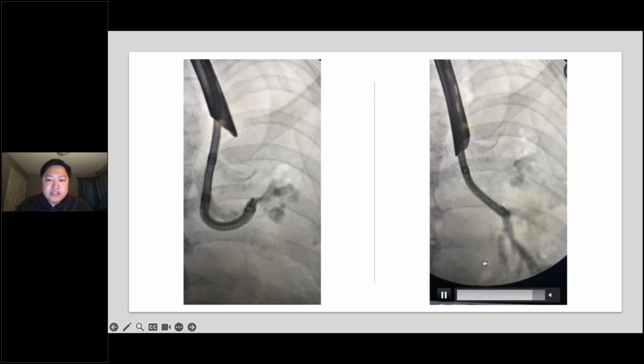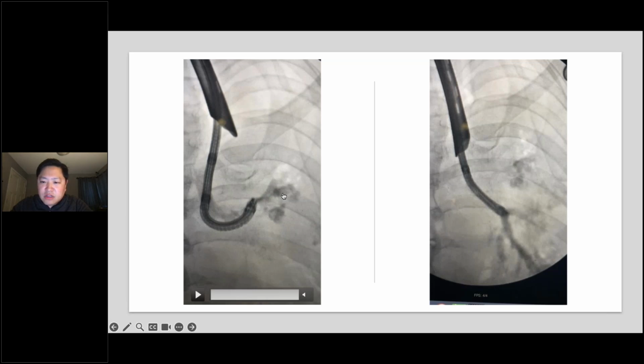When you look at this patient, we knew on the CT there was a left upper lobe mass, and it was so infiltrative that there's nothing really patent in that left upper lobe. The way we teach the fellows is, if you're really looking for lobar patency, if the contrast doesn't go distal, it may not be favorable to open this up or place a stent.